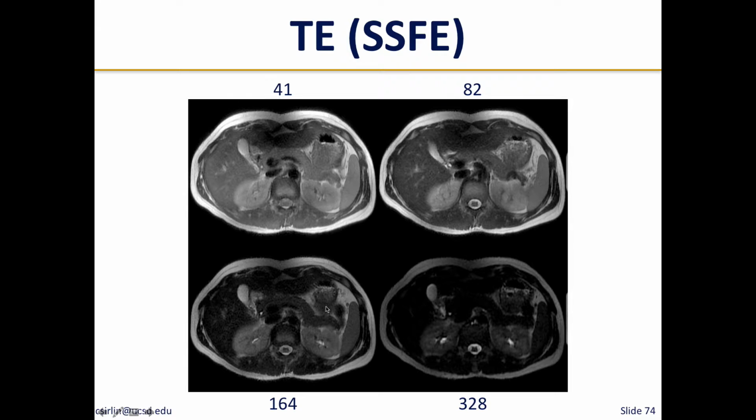But is it true that a T2 weighted image is more T2 weighted for all structures? And the answer is no. Because if you had to say, can you tell the difference between the liver and the spleen, you would say, geez, the liver looks black, the spleen looks black, I can't really tell the difference. If you're interested in looking for metastases within the liver, remember, I said the spleen is your surrogate for metastases.